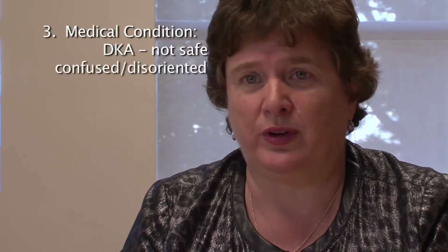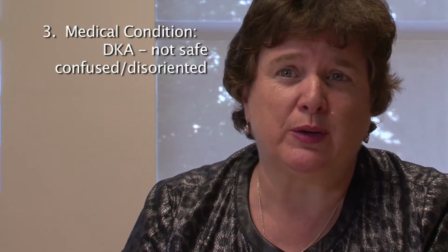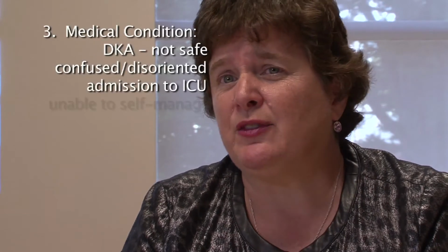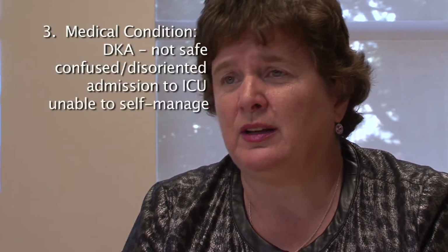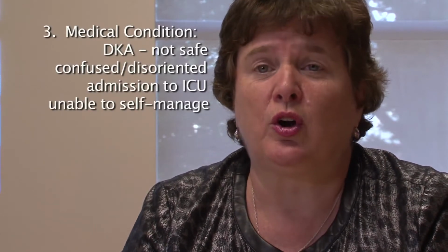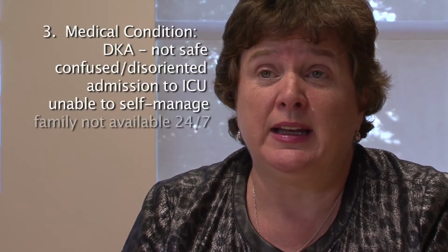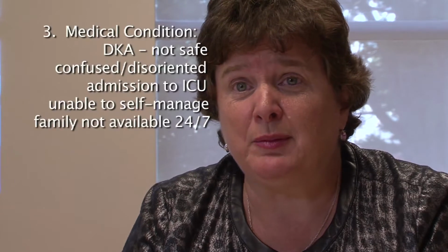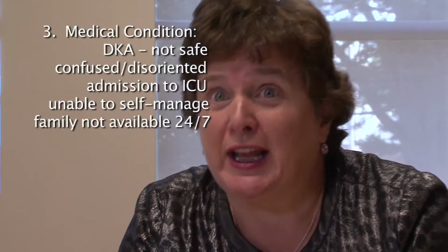And finally, they have to have a medical condition that will allow it to continue. So if they have DKA, whether or not they want to continue the pump, it's not possible because it's not safe. If they're confused or disoriented, if they have a severe medical condition that requires admission to ICU, any of these, you could not continue the pump. If they're unable to self-manage for any reason, whether they become confused or they have a psychiatric illness that impairs their judgment, all of those are reasons not to continue the pump. And if they're a child and predominantly the family is helping to control the pump, if the family is not available 24/7, you can't continue the pump.